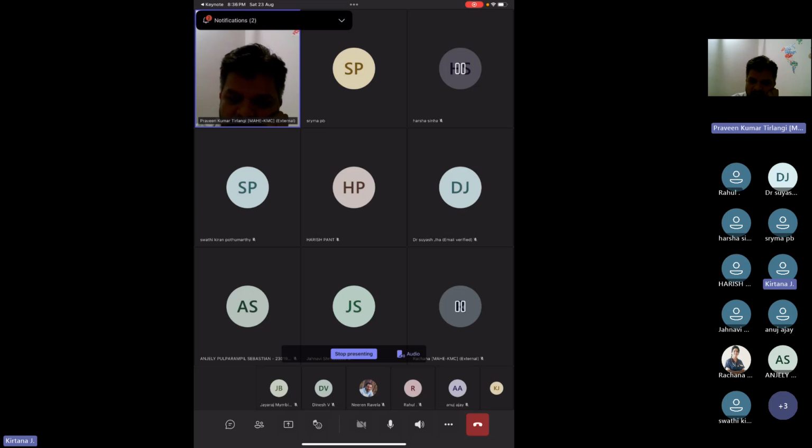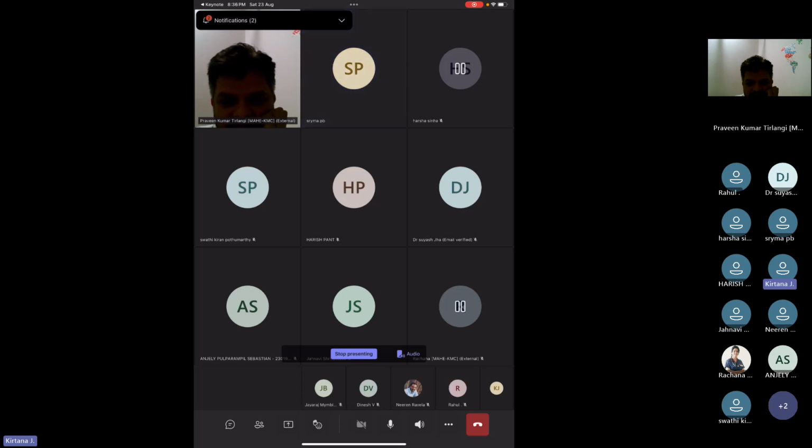Ayush, if you have calculated a patient's mechanical power in ARDS, and if it is like 25, what will you do? You will come down on respiratory rate or tidal volume? Honestly speaking, I've never used calculation of mechanical power in my clinical practice. I think the more proven concepts that have been there for a longer period of time need to be looked at first. So obviously look at your driving pressures, look at your plateau pressures. The ARDSNet protocol is a very valid protocol, and if we are able to use it correctly in most of our patients, we are doing justice.